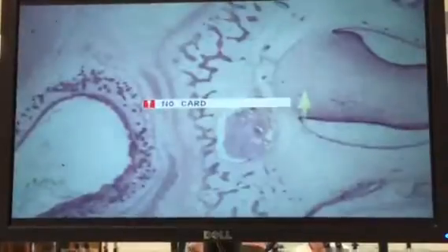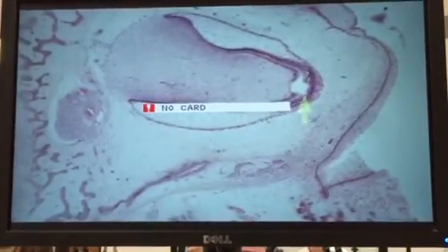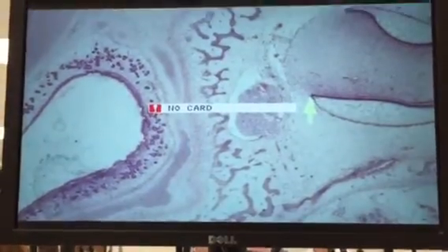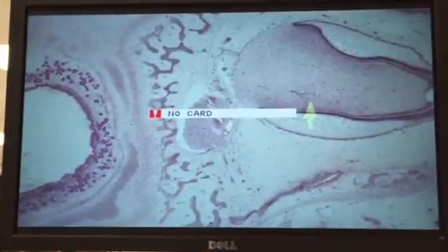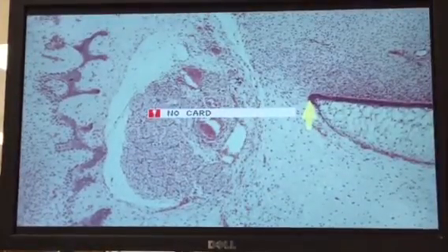So here, let's go down in navigation, see what else we can find on this slide. Okay, we have a little bit of a tear up here, but as we look at this, when we come down to the cervical loop, if we start there and go up towards the cusp, we can find at least 3 of the stages of the ameloblast life cycle in these coronal sections of pig embryo. So as we go up in magnification, there's the cervical loop.